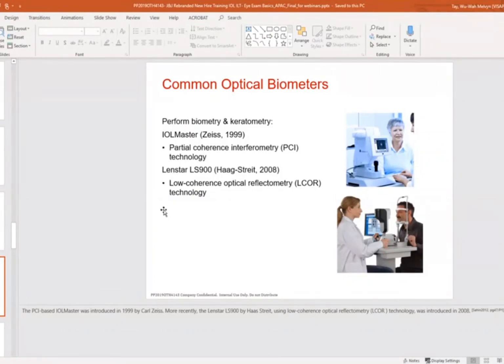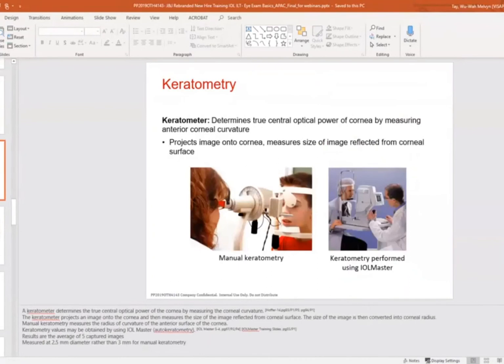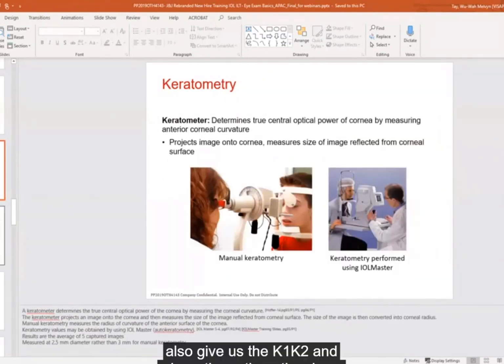Yeah, Melvin, I'm asking a lot of questions, but let me take this opportunity of asking one more. When we say manual and optical, especially when we talk about keratometry, manual will be giving us the value of the curvature of the anterior surface of the cornea. That means K1, K2 we'll get. And when it comes to optical, you said topography will get us the curvature, where exactly is the astigmatism. So as per my understanding, even for the anterior surface of the cornea, the manual will also give us the K1, K2 and where the astigmatism is on the anterior surface. Is it right?